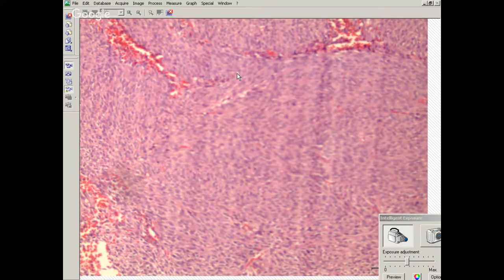You can have melanoma that's widely distributed over the entire leptomeninges, and you can also have melanoma arising in a melanocytoma or melanoma as a nodule. Melanoma can look like anything, but melanocytoma is something that you do need to remember about. Most, however, are pigmented, like normal melanocytes in other parts of the brain, or melanomas anywhere. Most are pigmented.